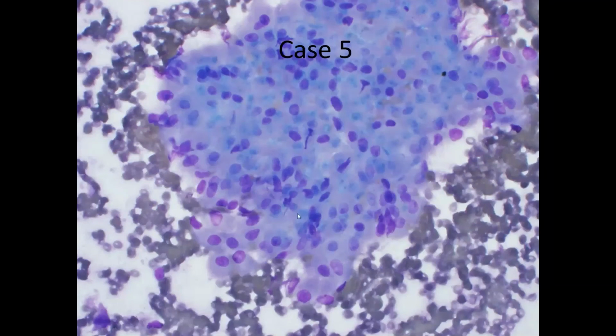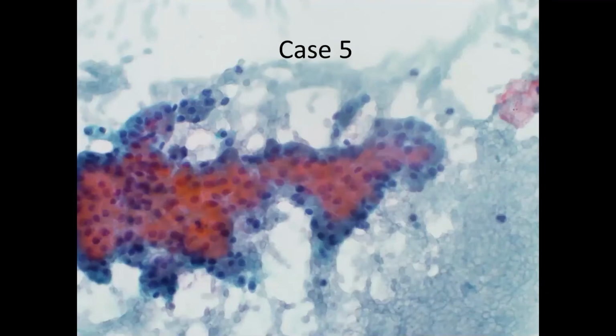But the key thing is that you can appreciate that on a cell-per-cell basis, these cells are oncocytes, just like the oncocytes that we saw in our Warthin's tumor. Again, nuclei are bland for the most part. They've got little nucleoli, and they have this densely packed, very finely granular cytoplasm that you can appreciate here. Again, very similar cells as the Warthin's tumor, but completely different arrangement. The groups are much more three-dimensional. You don't see the flat sheets, much more three-dimensionality to these groups.